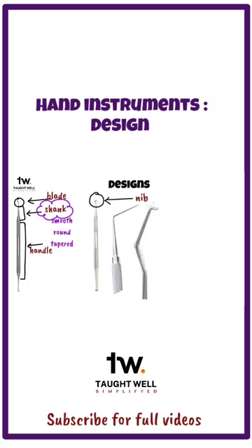Handles are available in various sizes and shapes. Most instrument handles are small in diameter, 5.5 mm, and light. They are commonly 8-sided and knurled to help with control.